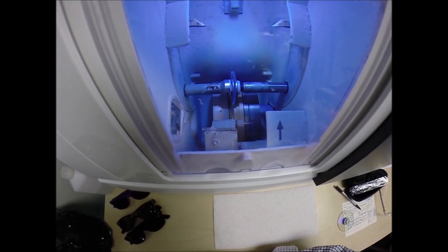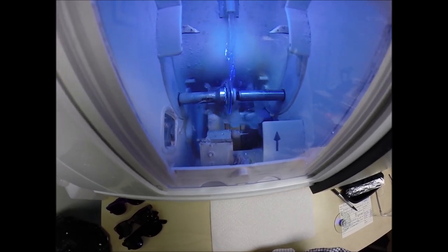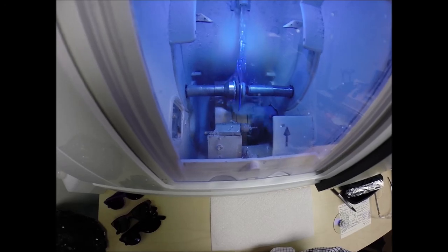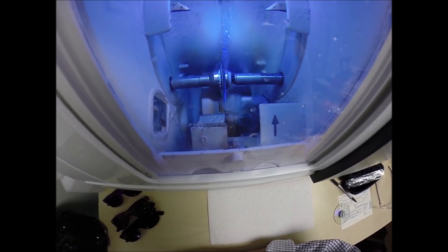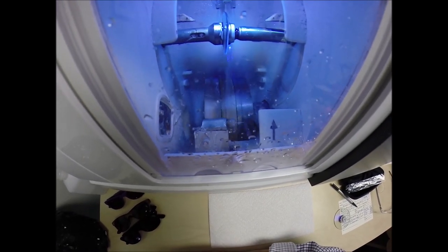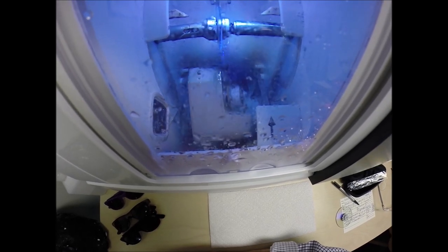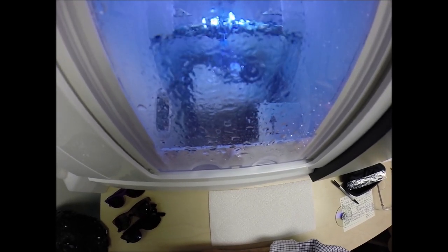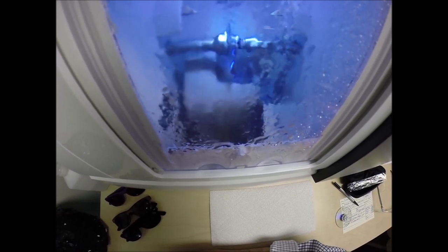So the lens is on the bevel wheel. Now you have the Zeiss Blue, so water has begun spraying on it, which tells me it's in the last 20 seconds of the cutting cycle. In just a moment, a little bevel wheel will come out of the foreground to put the safety bevel on the back surface of the lens. Cue the lever. But you have the Photofusion Blue, which offers 30 to 40% blue light protection.